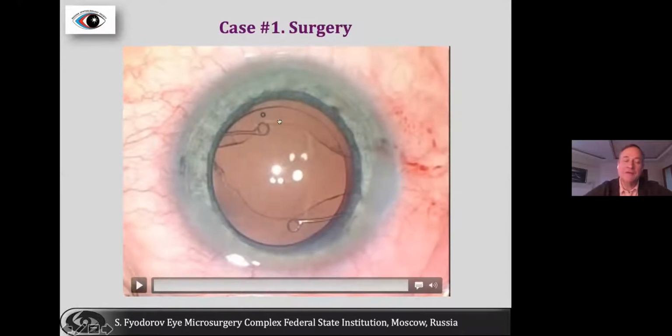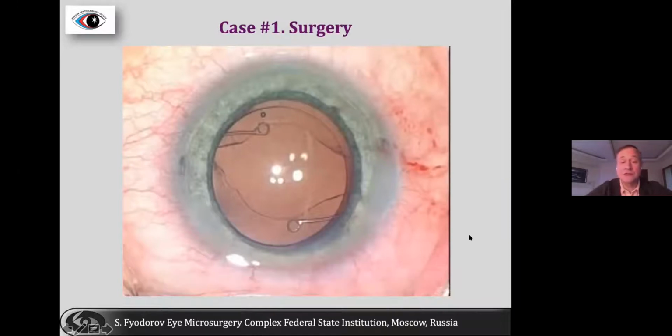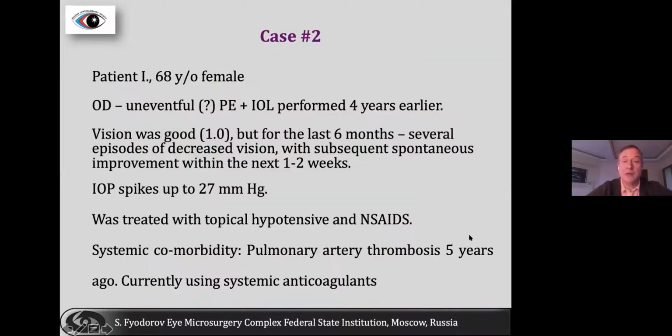At the end of the surgery, we decided to place the leaflets of the anterior capsule on top of the optics, to additionally avoid possible contact between the optical edge and the iris. So you see these two areas where the capsulorhexis was torn radially, which was resulting in lens dislocation, and this new lens sits very well in the capsular bag.